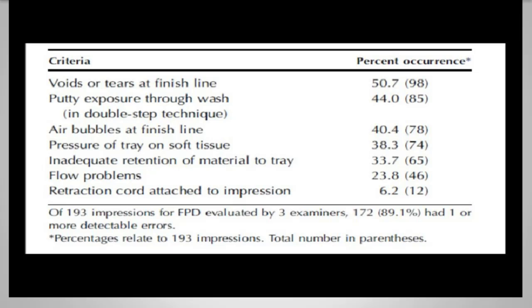The good news is that we can make impressions predictable and greatly minimize the number of errors. Impressions do not have to be a fact of luck. In reality, it's all about technique. We don't have to feel like we got lucky when an impression is taken out of the mouth. It is all about technique, and I hope to share a lot of that technique with you today.